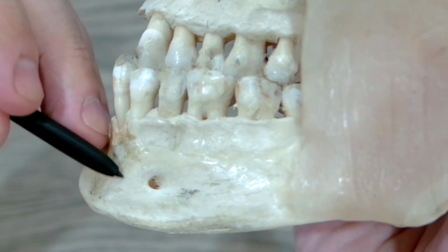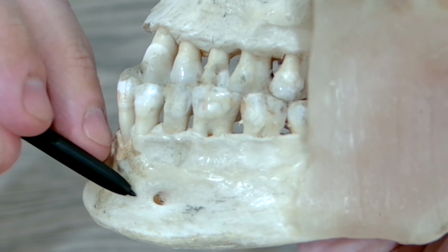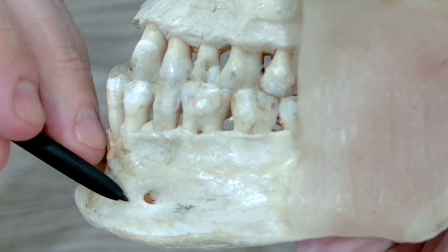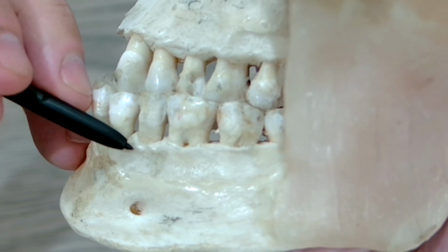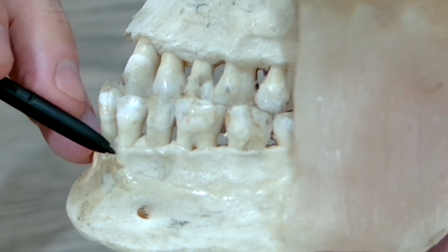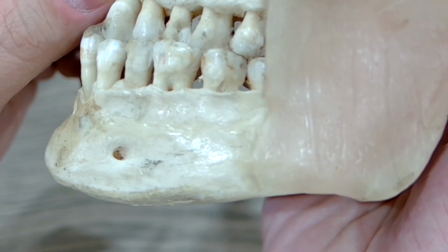So why is this important here? Because you want to leave 3 to 6 millimeters of clearance anterior to the mental foramen if you're placing implants in this area. So it's very important to be able to visualize where that landmark is.